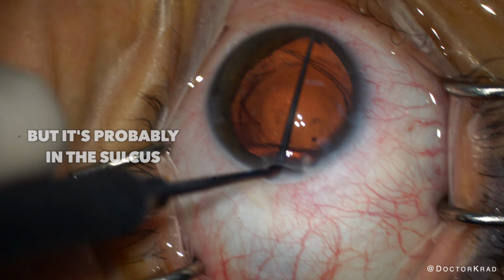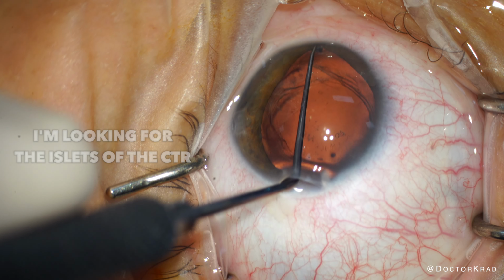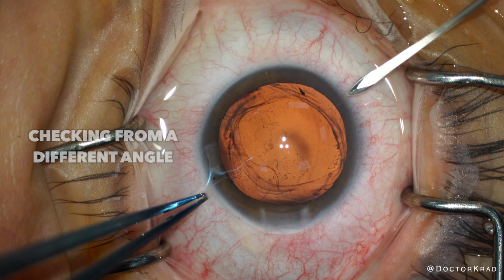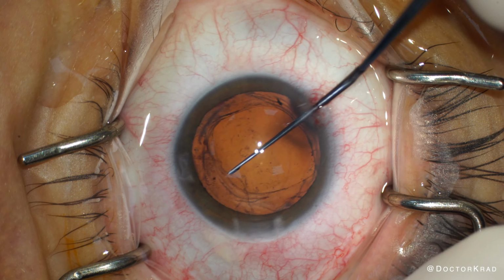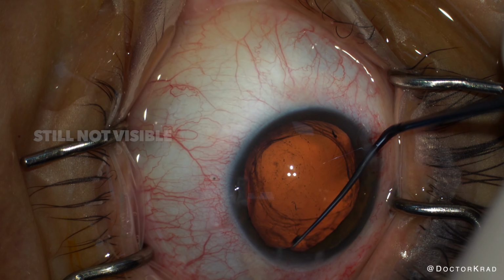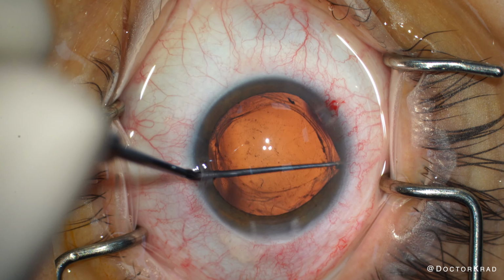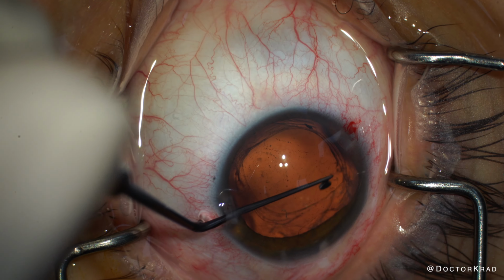If the CTR is in the sulcus, at least it's very smooth and small, and it should be able to sit there safely. It's not designed for that, but we put three-piece lenses in the sulcus safely all the time, and so this is basically just like a haptic sitting in the sulcus. If I don't see it, I'm not going to try to reach blindly into the sulcus to grab it. This patient, during her second surgery, had bleeding, so I don't want something like that to happen again.